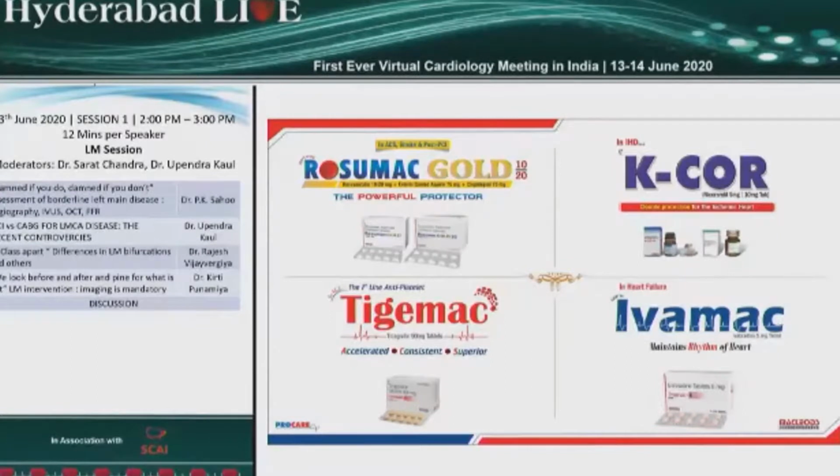And one of the issues with proximal left main deformation of the stent, which I have covered in my previous talks, has been that we choose our stent based on the LAD. So if the LAD is 3.0, then we take a 3.0 and let a large left main house a 3.0, and these malapposed stents can get extremely distorted and deformed with the touch of a guiding catheter or even with the entry of an NC balloon. But if we were to rethink our strategy and start taking larger stents and deploy them at lower pressures, extending into the first branch or the second branch, then you will have more room.